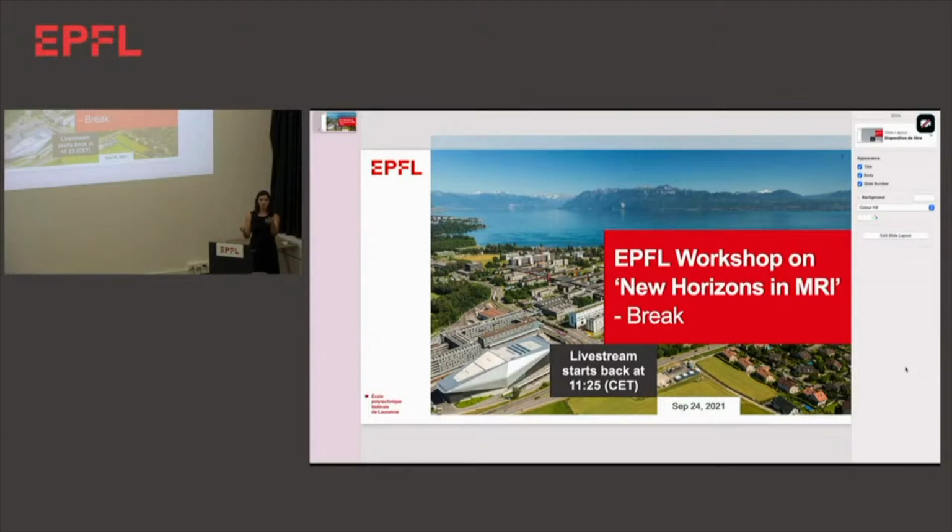I think this is a funny thing that happens in fingerprinting, where I can give you a map with a perfect SNR, but it won't actually quantify anything. All I have to do is have 2 T1 entries and 2 T2 entries, and the whole thing will just be flat. So this is a funny decoupling of the SNR in your maps from the measurements that you're making, that you have to be careful about.